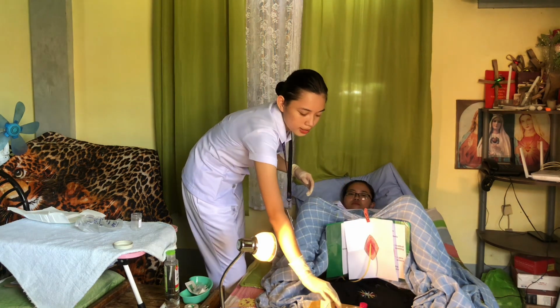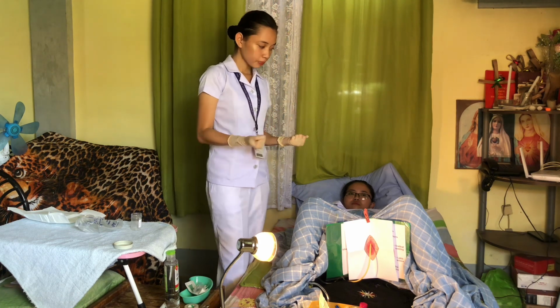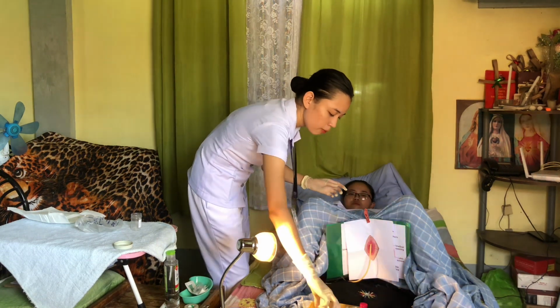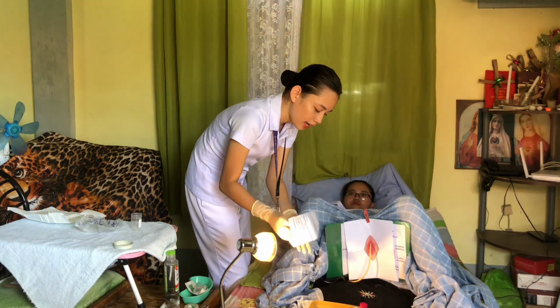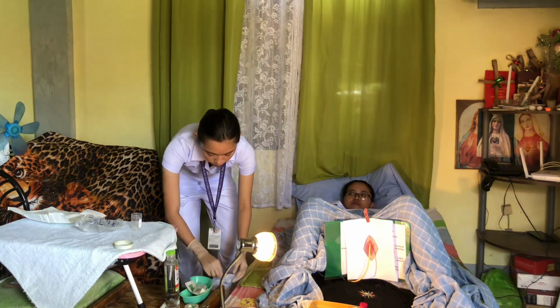And of course, we also have to provide some slack to accommodate the patient's movement. After that, we remove this. We must put the urine bag on the side of the patient below the bed.